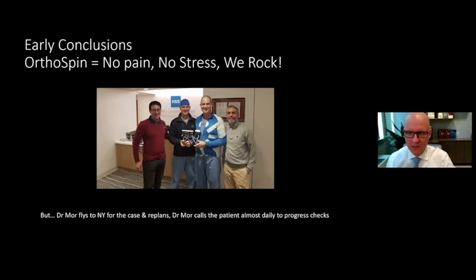And there's no great system that has an algorithm for if one strut moves 2 a day, another strut doesn't move at all. How do you split up this strut into 2 times? It's hard to explain this to people. And some of them get a little bit confused and it can be uncomfortable. So we were very happy about this automatic adjusting.